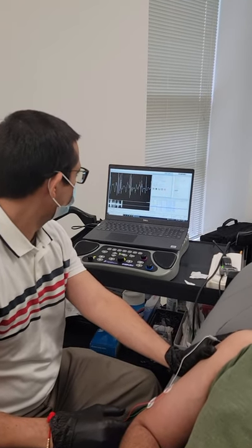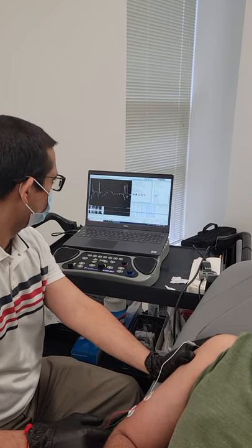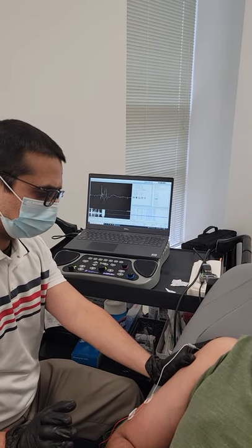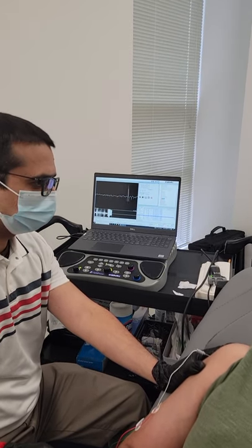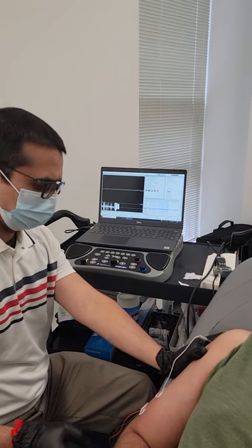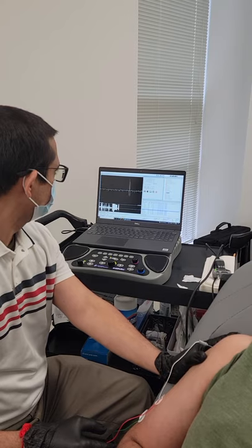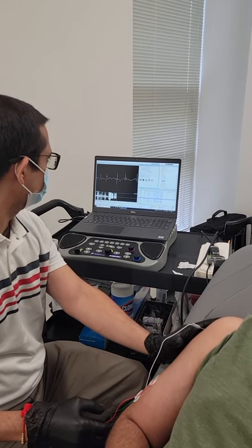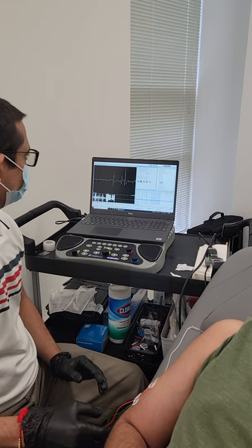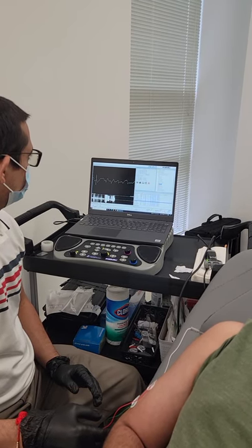Okay, breathe out slowly. Slowly, slowly — this is too much, relax. Are you relaxed? Yeah. Push again, slowly — a little bit, slowly, slowly. That's too strong. Okay, stop, stop.